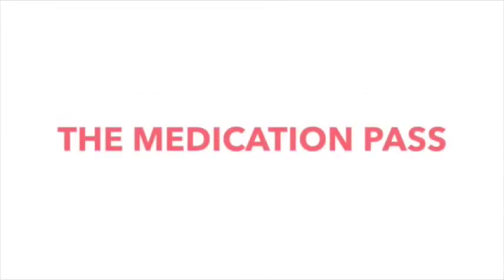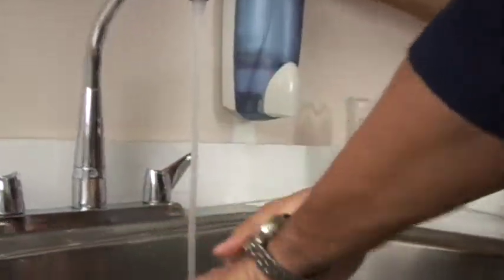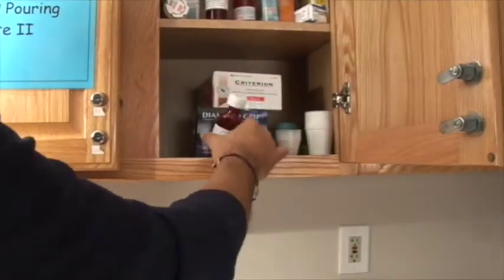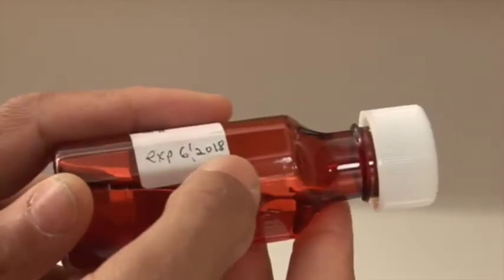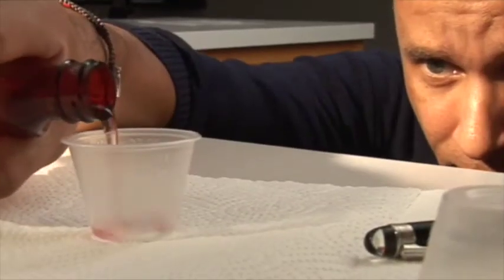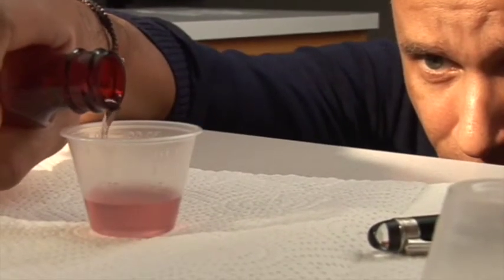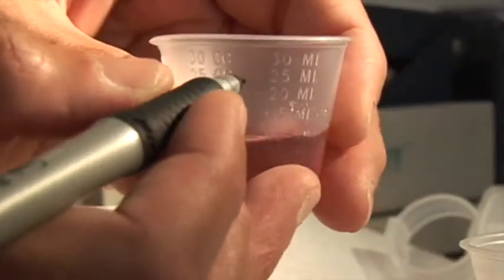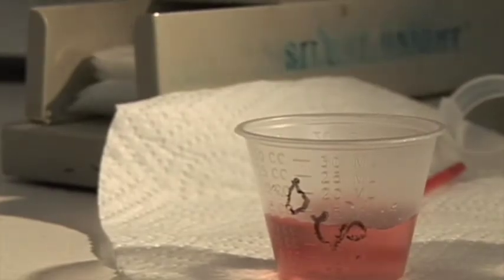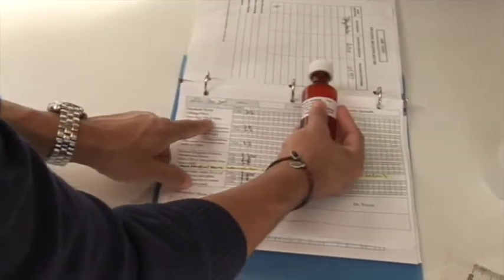The medication pass. Be sure to wash your hands properly: wet hands, apply soap, use friction for 20 seconds, rinse well, dry with paper towel. Check the medication label to the MAR twice before preparing the medication solution, and label the medication cup with the name of the medication. Once again before putting it away in the medication cabinet, totaling three checks.